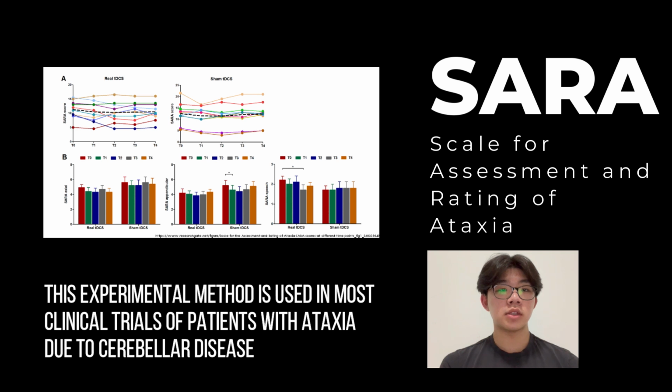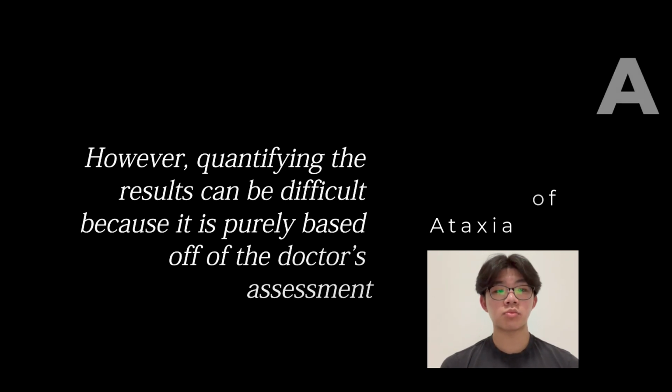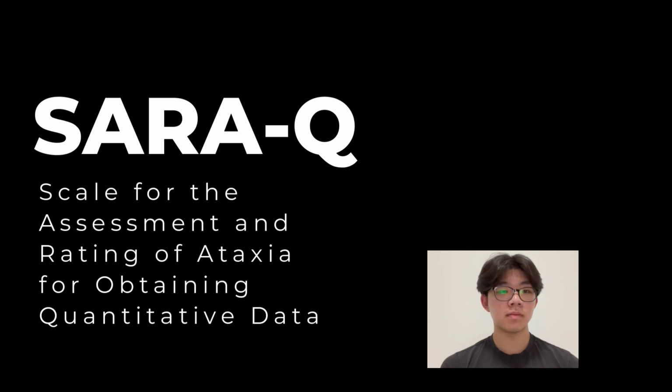This experimental method is used in most clinical trials of patients with ataxia due to cerebellar disease. However, quantifying the results can be difficult because it is purely based off of the doctor's assessment. To solve this problem, we developed the Sara-Q system.